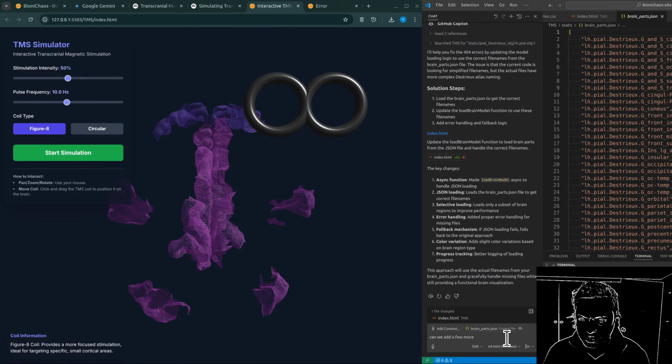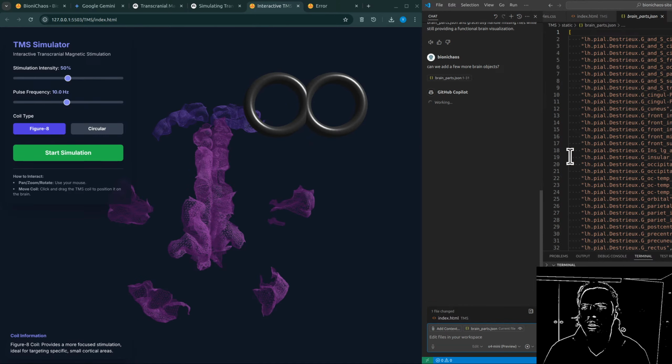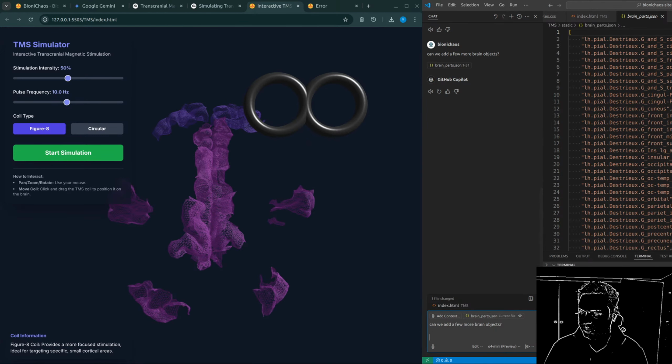Which could be particularly useful for things like interactive treatment planning, trying out different spots virtually. Very cool. Okay, so we've progressed quite a bit. We've built the digital head, modeled the coil, calculated the precise electric field it induces everywhere in that digital brain. But knowing the E-field intensity, the sources say that's only part of the story. Exactly. It's a critical part, but it's the trigger, not the whole response. So the next stage takes us deeper into the neuroscience, simulating the actual neural response.